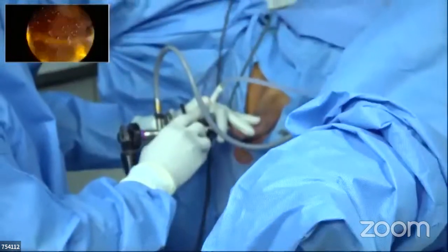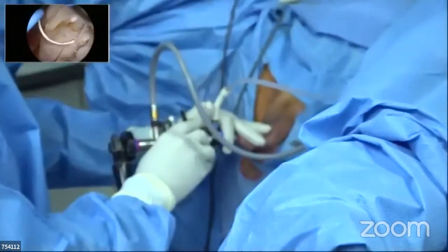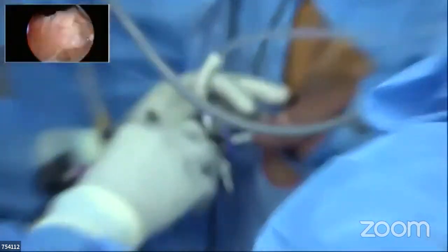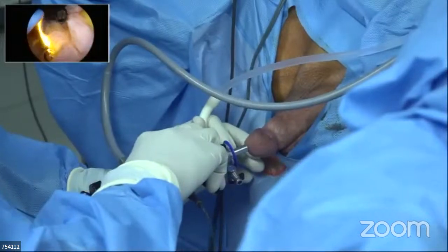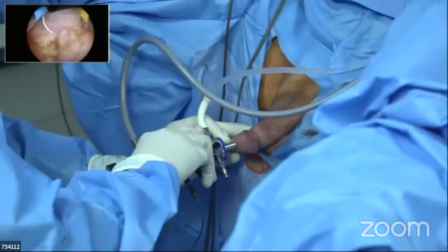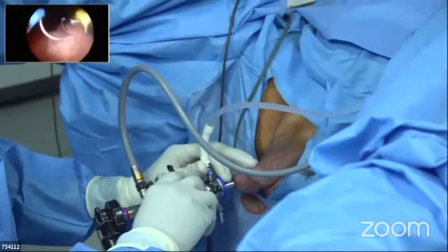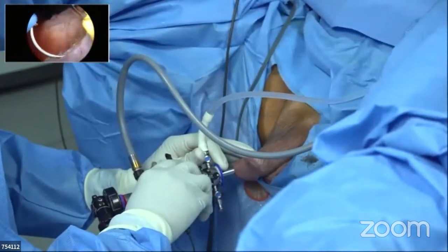So you need to adapt to a procedure wherein both your hands are working. I would say the active hand is going to be the left hand and the passive hand is going to be the right hand. The right hand has only one movement, that is inside and outside of the loop. The left hand determines the movement of the loop inside and the depth of the loop inside the tissue. So this is the first resection element between the bladder neck to the mid of the prostate or the 2/3 of the prostate.